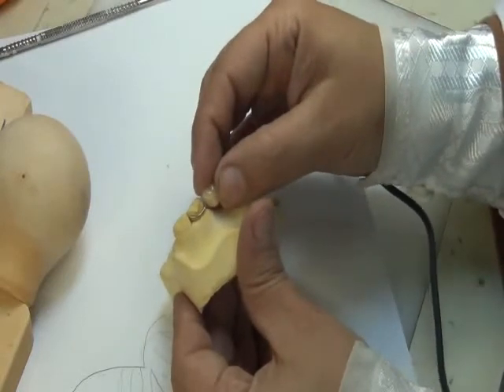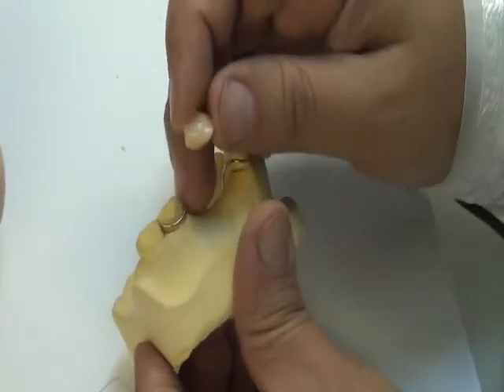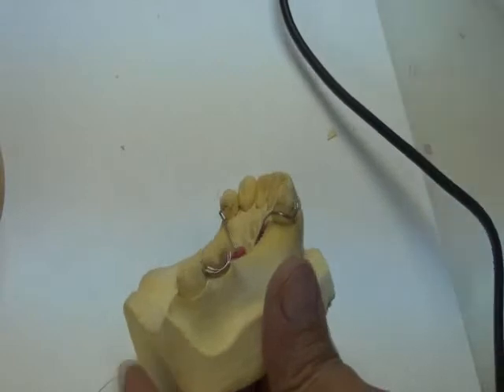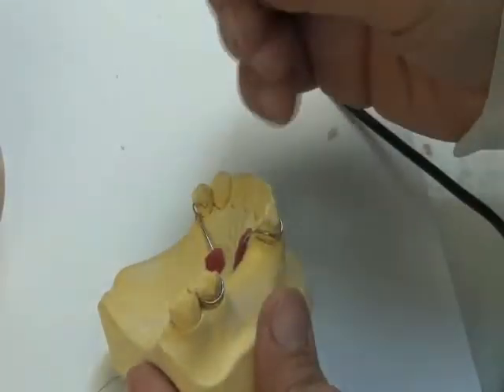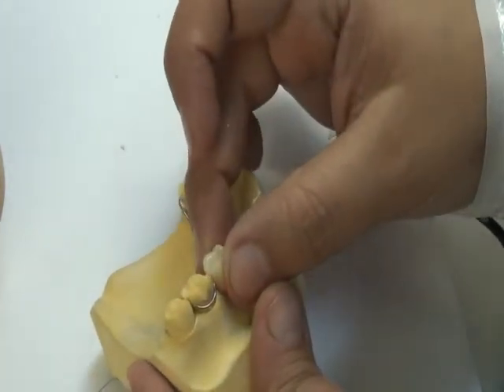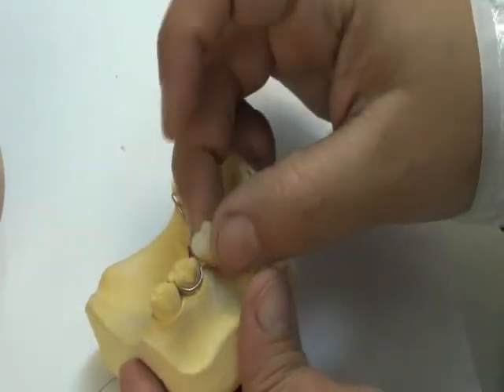If this doesn't come in contact, I should bend the wire a bit lower. So this is my criteria for the wire bending: the wire should not interfere with the contact of the natural and artificial tooth. So check your wire before you begin your work. This wire should go a bit downwards, not to interfere with this.